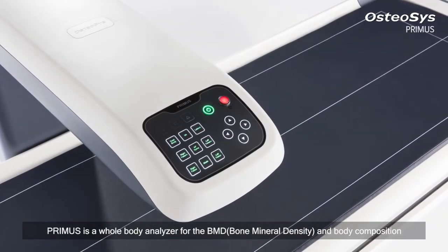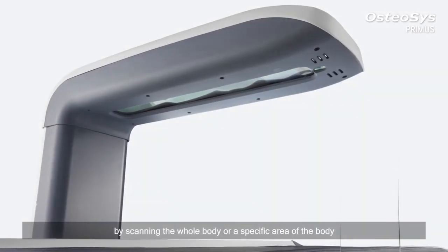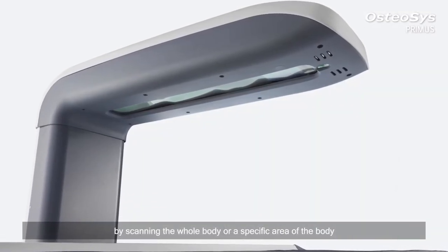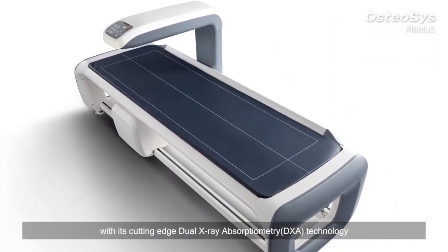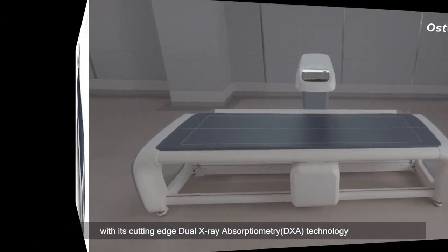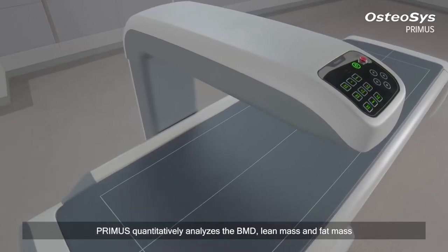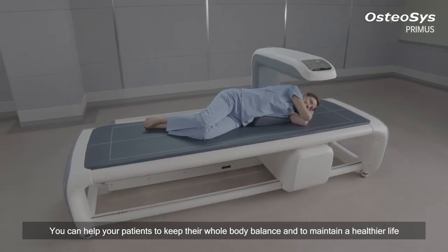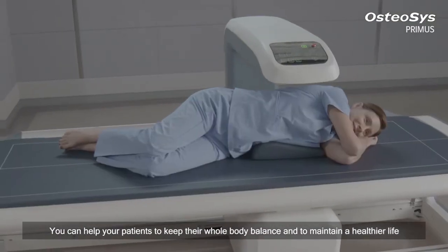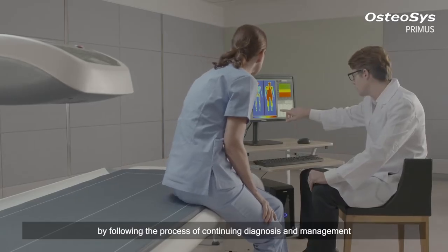Primus is a whole body analyzer for BMD and body composition, scanning the whole body or a specific area with its cutting-edge dual X-ray absorptiometry technology. Primus quantitatively analyzes the BMD, lean mass, and fat mass. You can help your patients keep their whole body balanced and maintain a healthier life by following a process of continuing diagnosis and management.